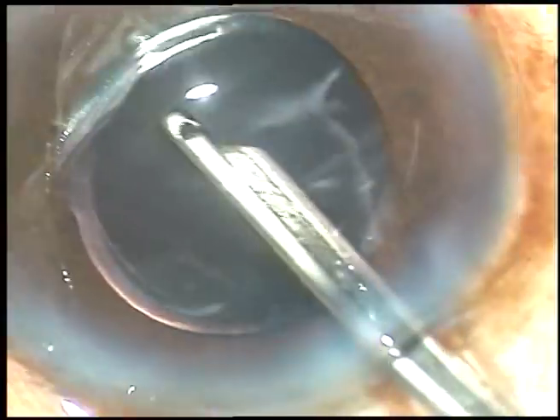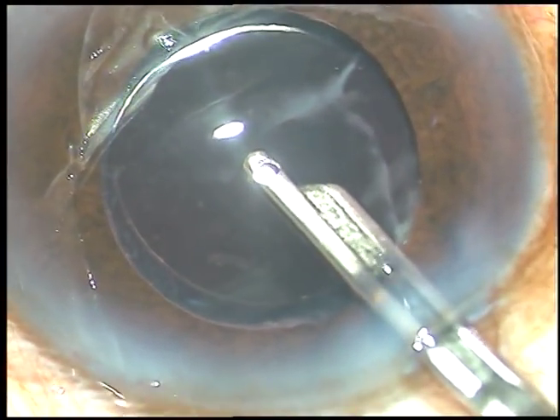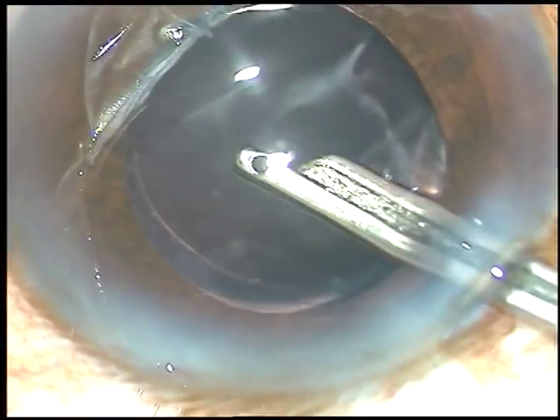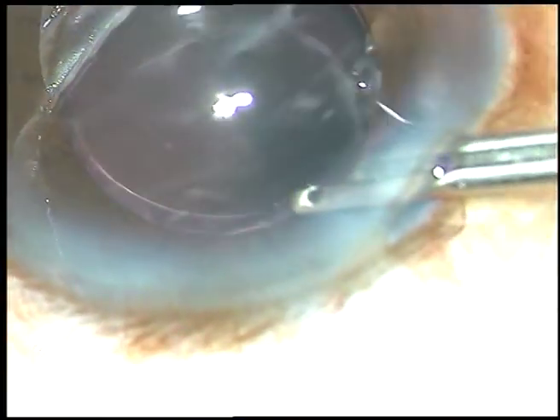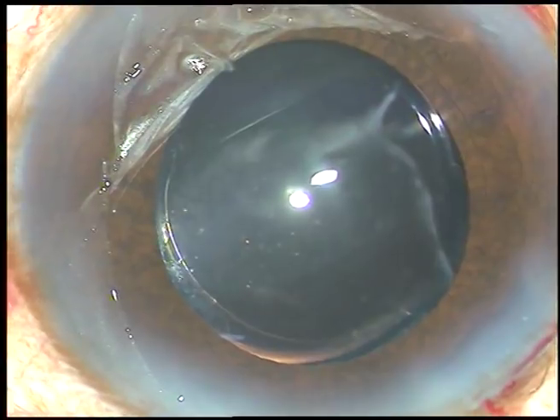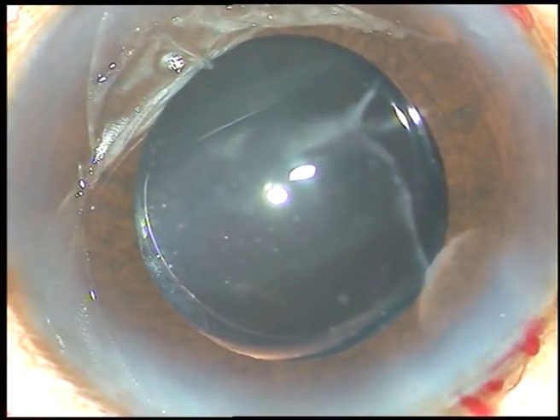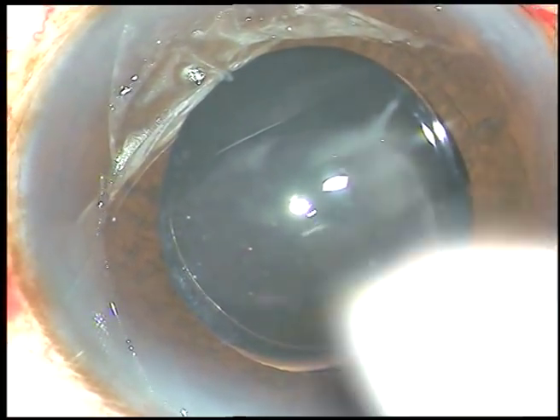And now, this is the final lavage of the anterior chamber. Whatever viscoelastic substance sticks to the corneal endothelium comes out at this time. The capsular bag is also irrigated. The anterior chamber is formed and the case is concluded. After the anterior chamber is formed, please check the integrity of the wounds — there should not be any leakage from any side. Hope this video will help you in developing your surgical skills. Thank you very much for watching.